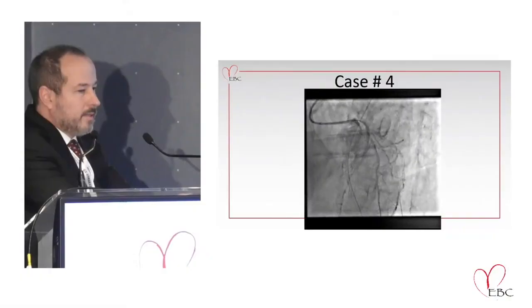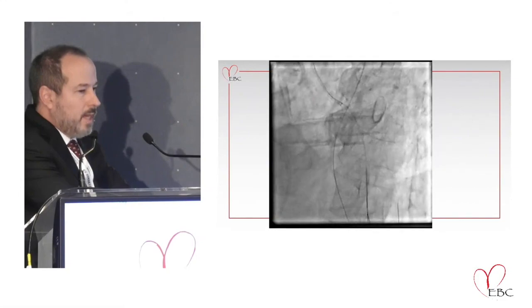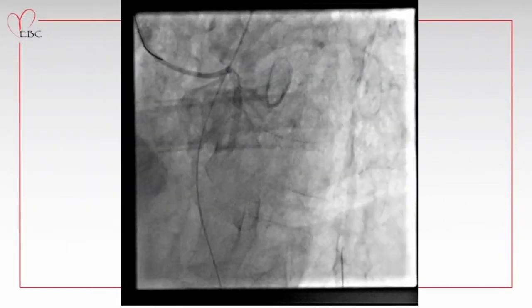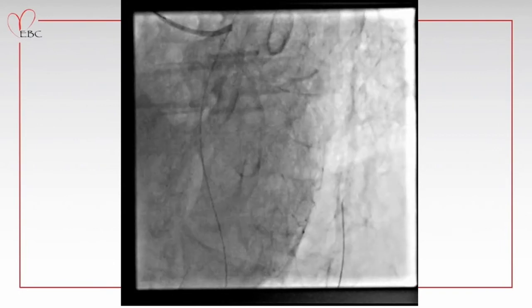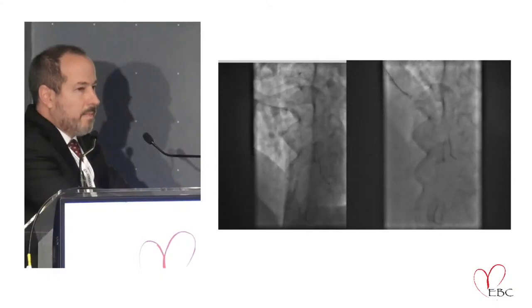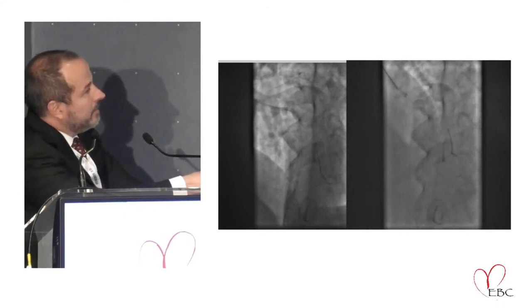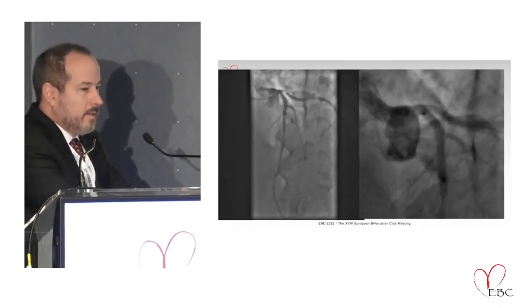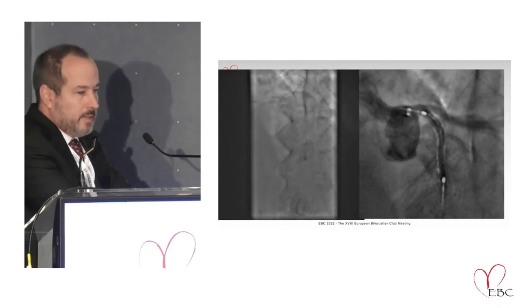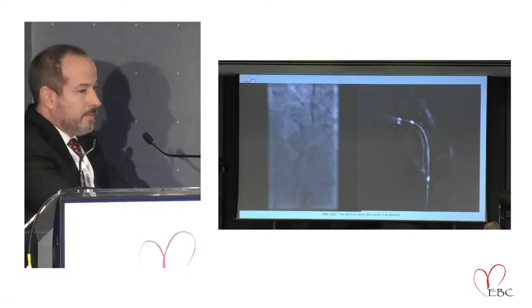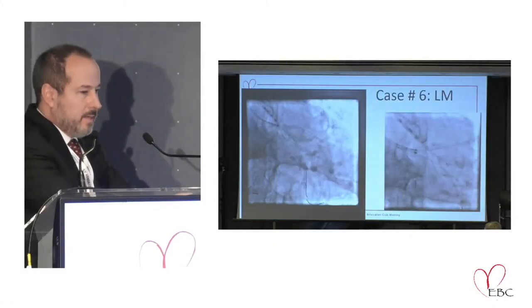This is another case — our fourth case done. As you can see, we are now trying to pull, and the guide catheter gets perfectly well seated in the aorta with no damage in the final result. This additional case also shows no complications. Here is the stent boost depiction showing the stent is intact and not touched by the tip of the guide wire.